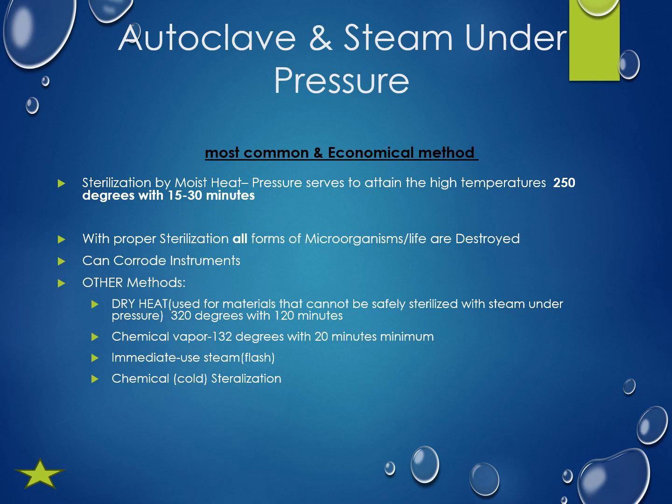With proper sterilization, all forms of microorganisms are destroyed. One of the drawbacks of this is that if they're not dried properly before autoclaving, it can corrode these stainless steel instruments over a period of time. We're also going to be discussing some of the other methods.